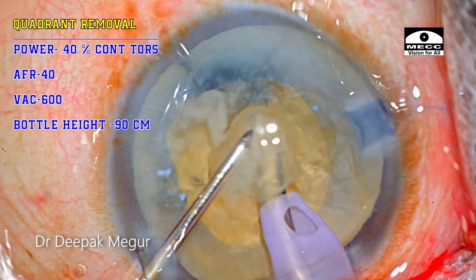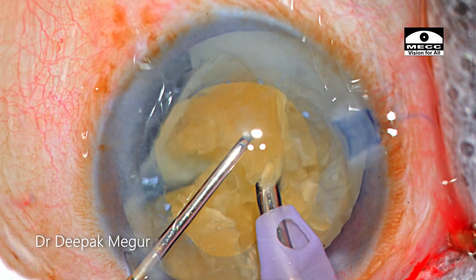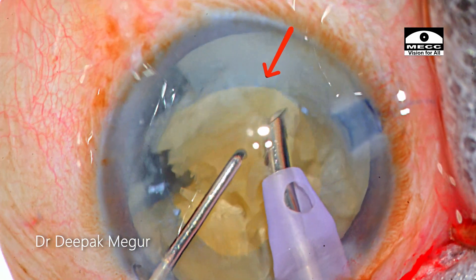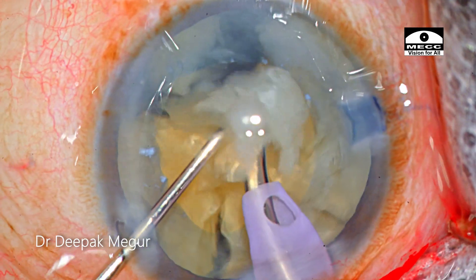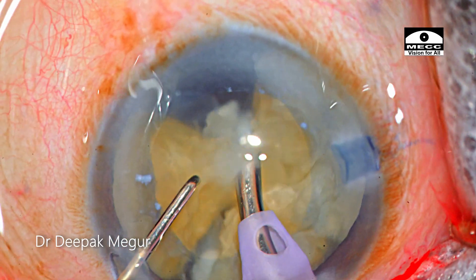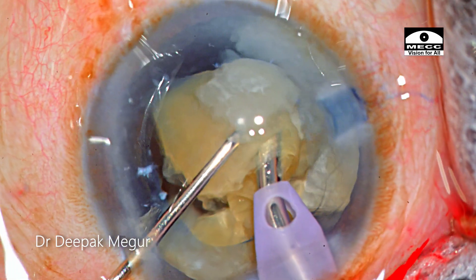Moving on to quadrant removal. Please note that the quadrant is not pulled out of the bag as it is being emulsified — some part of the nucleus is still rotating under the anterior capsule within the bag. The piece is brushing against the anterior capsule as it is being consumed. This suggests that the plane of emulsification is not anterior, and ideally this is the plane we should aim for in most cases.